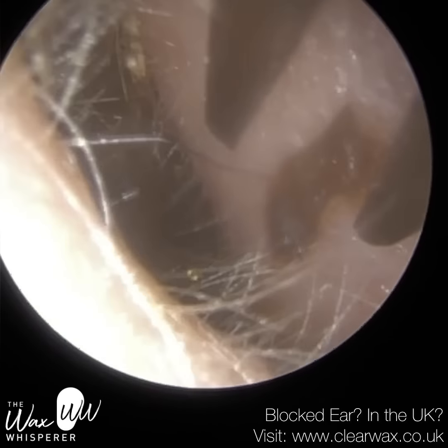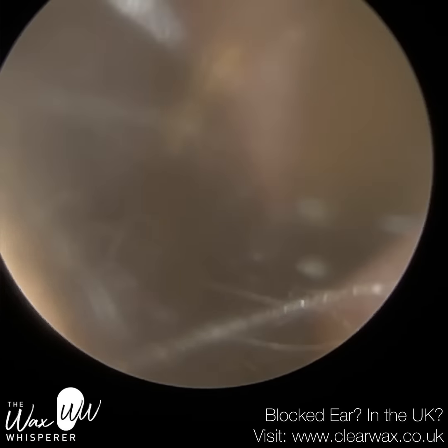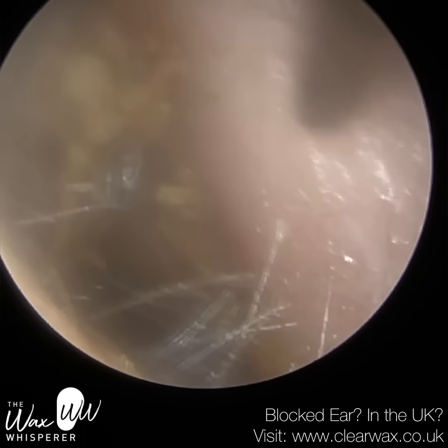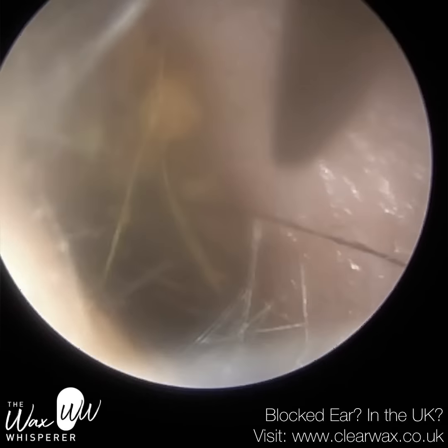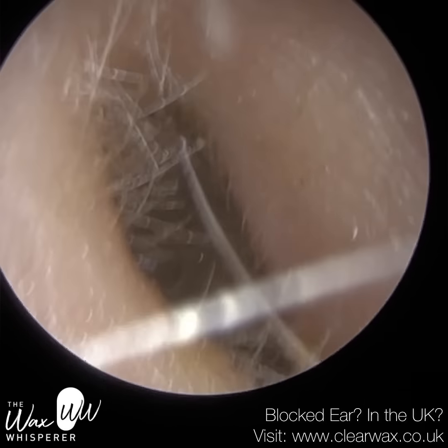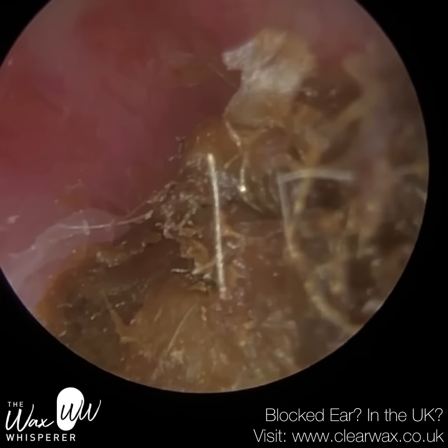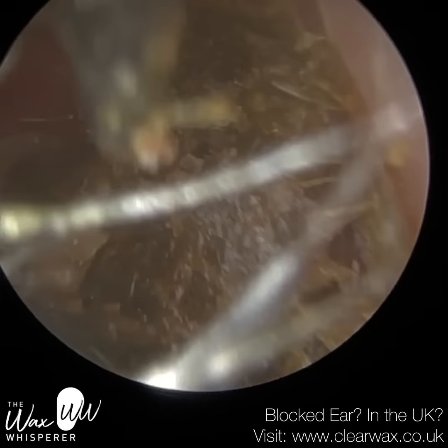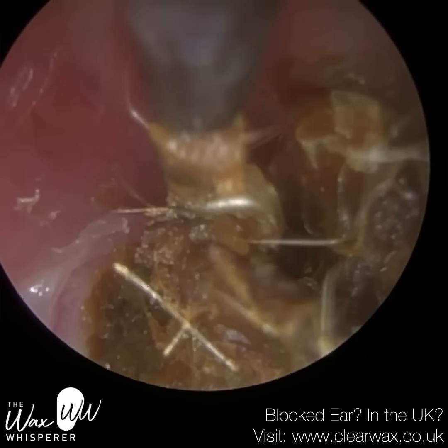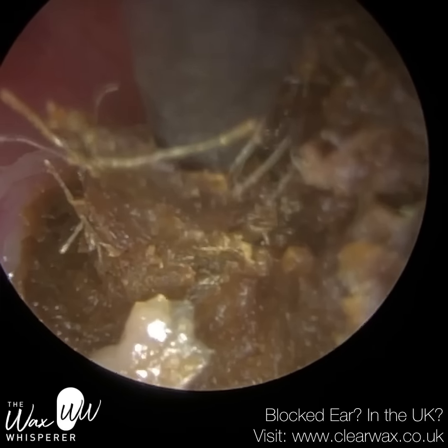And when you've got a grade 3 Keratosis obturans in particular, this skin plug is forever growing. It's getting bigger and bigger and expanding against the wall of the ear canal. So it's causing physical trauma. And then that leads to inflammation. And then the body's response to that is creating a granulation tissue. And you're going to see quite a significant widening of the ear canal, much larger than I thought. And on the left-hand side of the screen here, you can see there's a little ridge of the ear canal. And underneath that ridge, you've got this keratin plug really pushing up against it. And that's going to be quite evident later on, once I remove all this. And it's this section where the patient's ear canal has widened. So it's the midsection, so the bony portion of the ear canal.